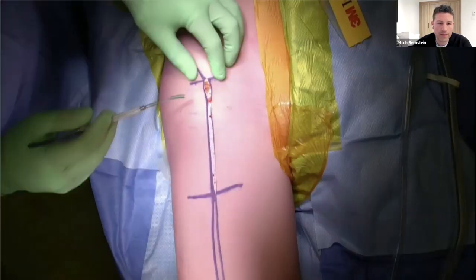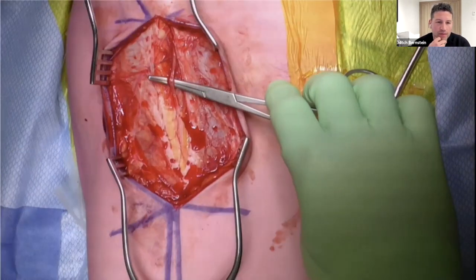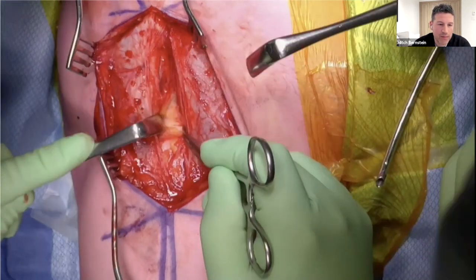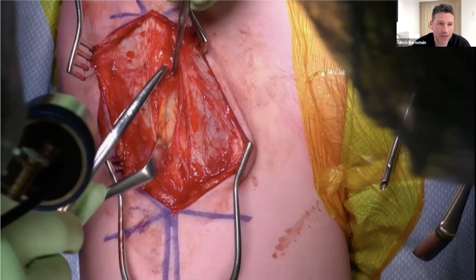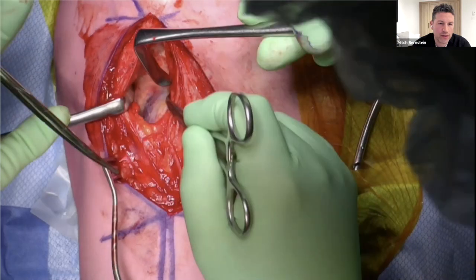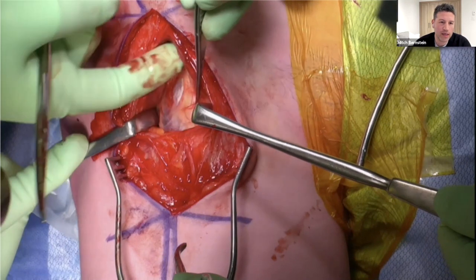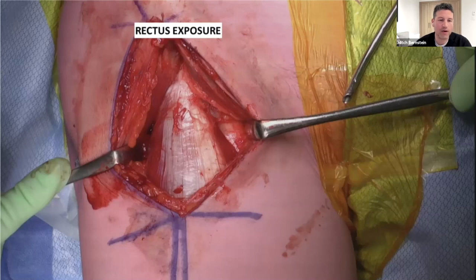So here's just a video that I wanted to show about the case. It's a fairly large incision, but deep, and the muscles are well protected. There's the lateral femoral cutaneous nerve. It's double speed, so apologize that it appears a little fast. Blunt dissection, identifying the TFL and sartorius. And then you will see a very large, big muscle, which really helps with the landmark of the incision. So that's your rectus exposure.